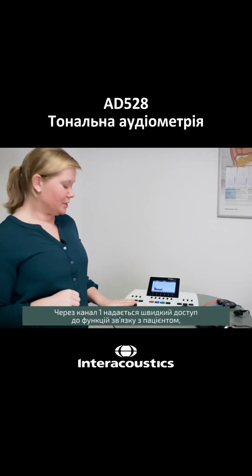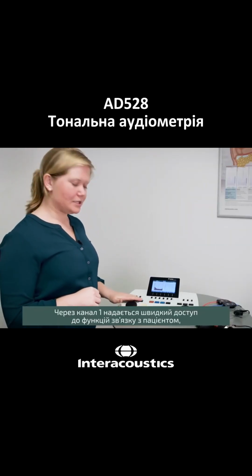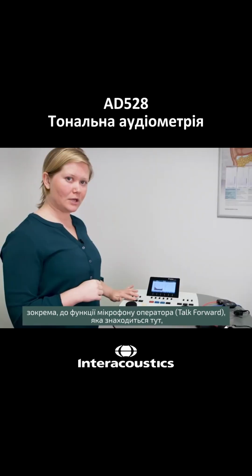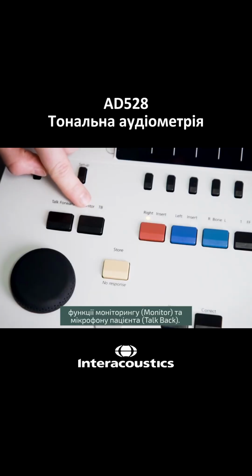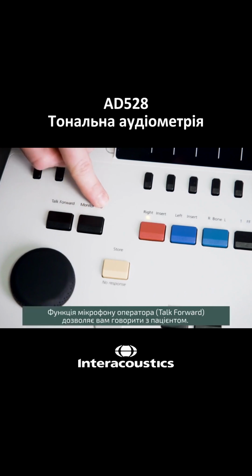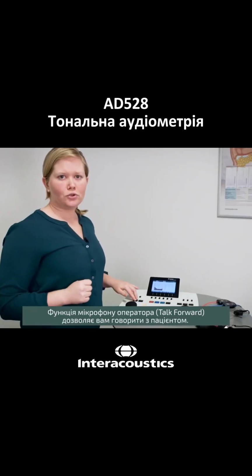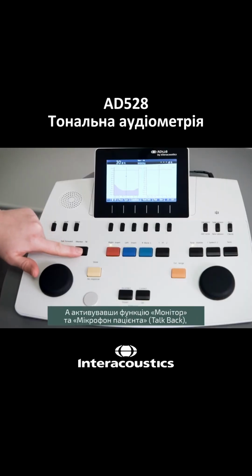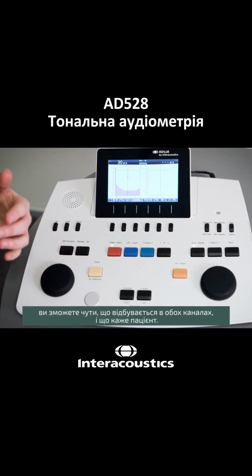So around channel 1 here, we have easy access to the patient communication. It includes the talk forward function that we have here, and the monitor function and the talk back function. The talk forward function allows you to talk to your patient by holding down the talk forward key, while you can enable the monitor function and the talk back to hear what is present in the channels and what the patient is saying to you.